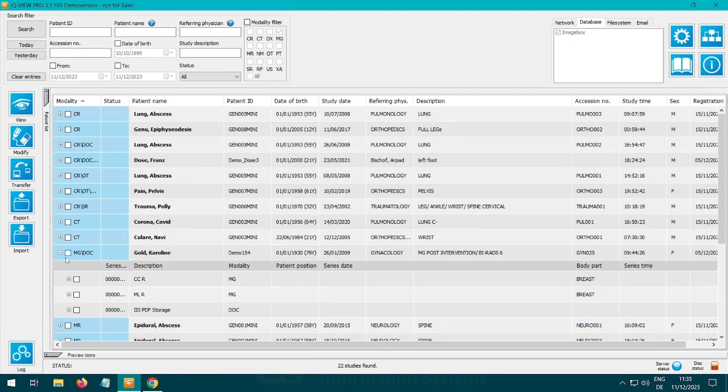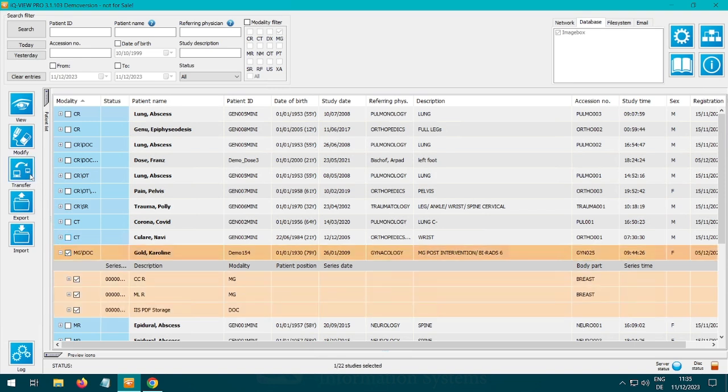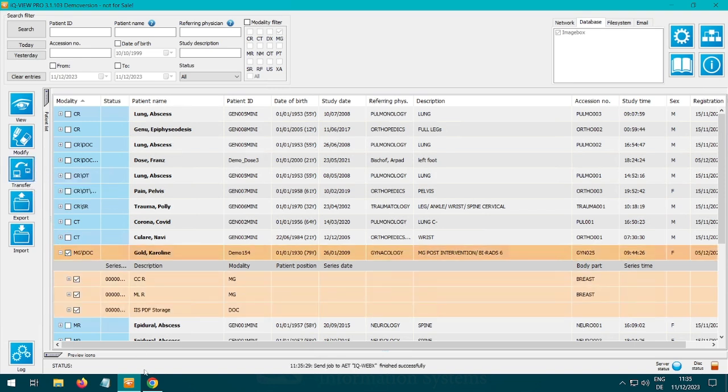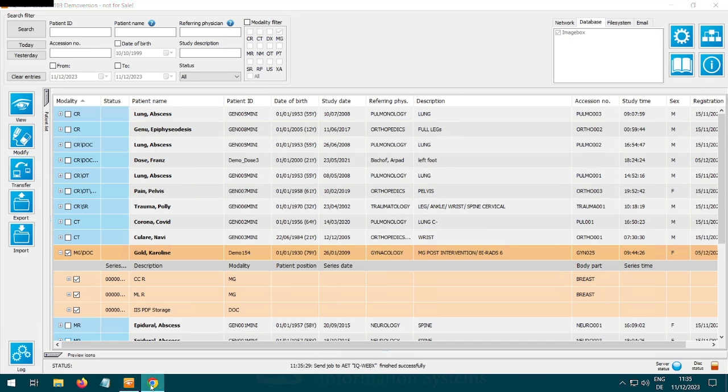If you now click on the small plus next to the study you will see the PDF. Now you can use the transfer button to send the study to the IQweb.